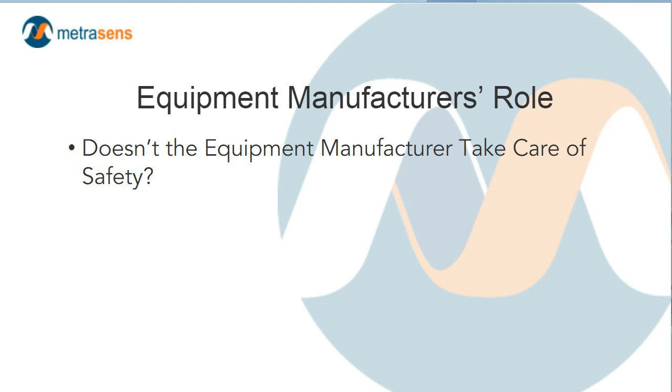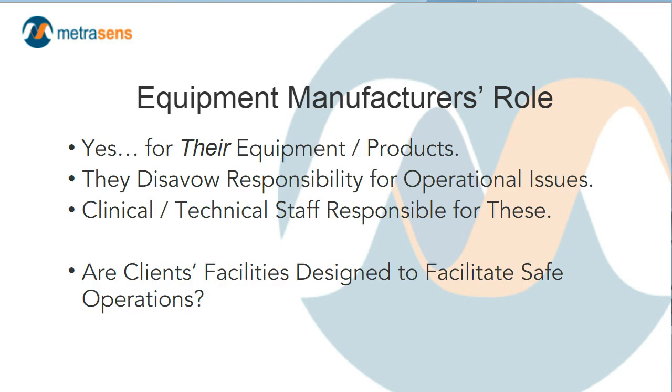And the short answer to that question is no. Unfortunately, we can't. In fact, the manufacturers disavow major pieces of the responsibility. Now, the equipment manufacturers do assume responsibility for their equipment, their device, their product, anything that has their logo, their label on it. But once you get beyond the things that have their logo on them, now you're really outside of the range of things that the manufacturer assumes responsibility for.